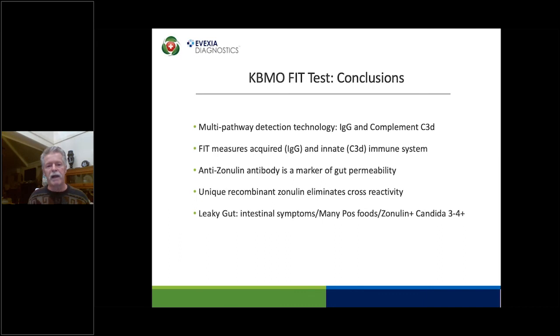So what people have thought would be, some people are very high responders, and there's a genetic component associated with that. And then you have other people that are low responders, and they're genetically predisposed towards that. So I would say it falls into both camps, but as a general rule, have the patient or client eat a normal diet, take the sample, and then let the test guide which foods are removed in the elimination phase.